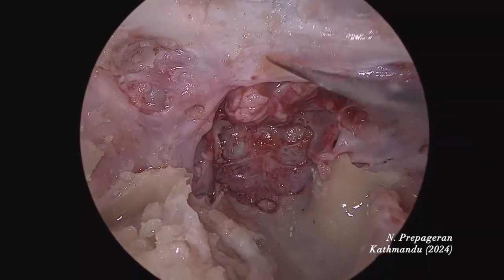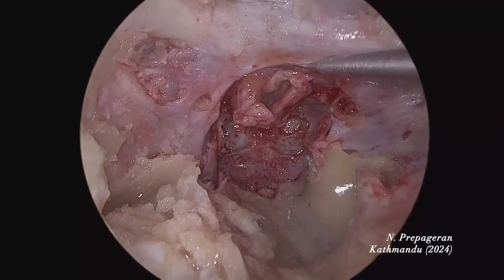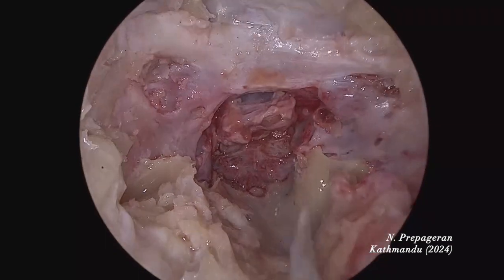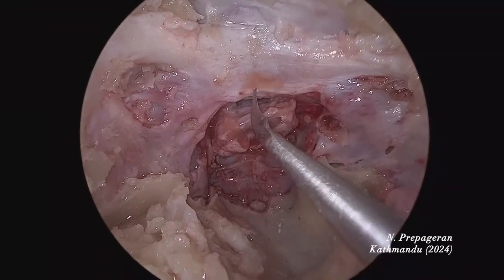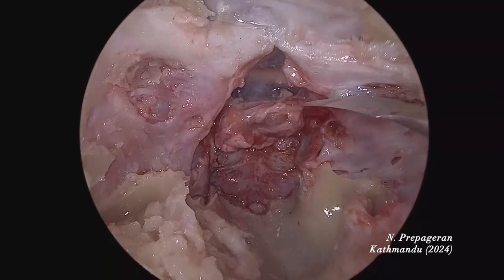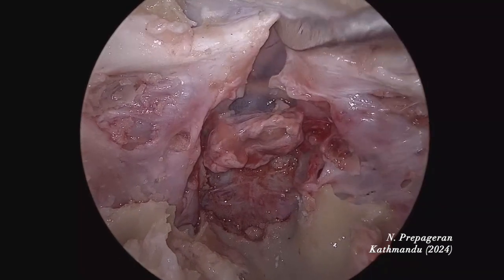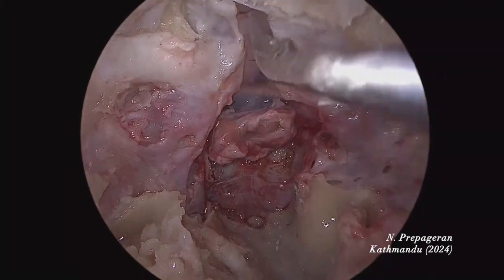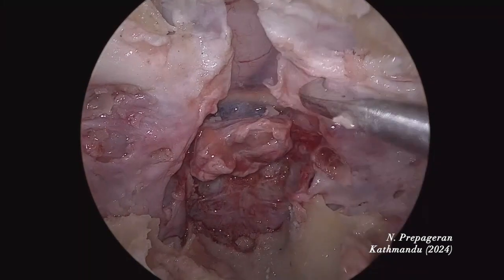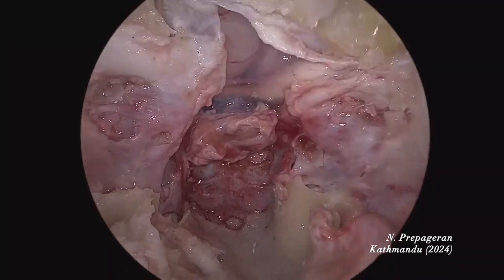That was the pituitary. I'm going to put the pituitary back down to where it belongs. Pituitary is back to where it belongs. Now we are going to open up the tubercle. When you open the tubercle, you see the optic nerve. I'm going to open up the planum as well. That's the frontal lobe coming into view. This is planum, tubercle, sella. Now I'm going to follow the optic nerve and dissect it all the way, as we did yesterday.